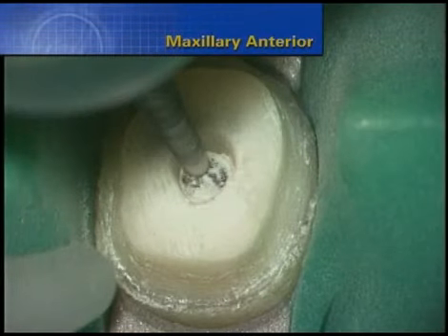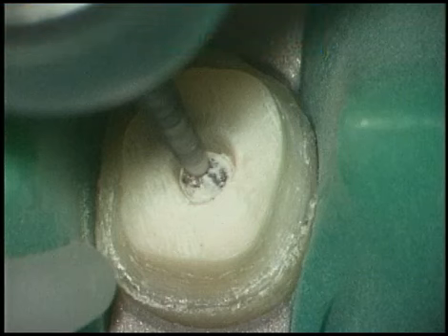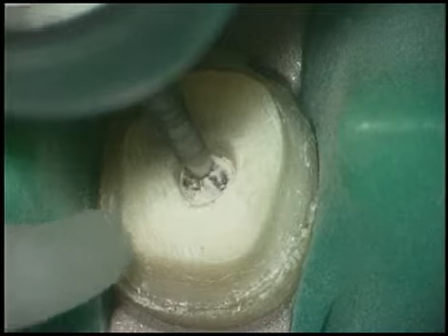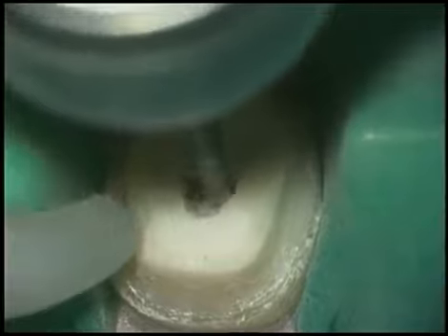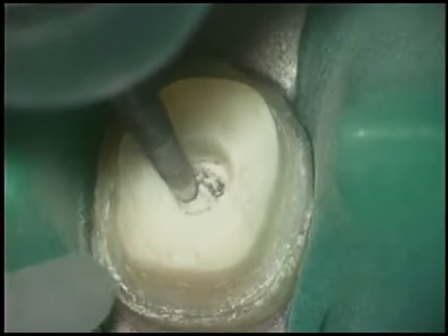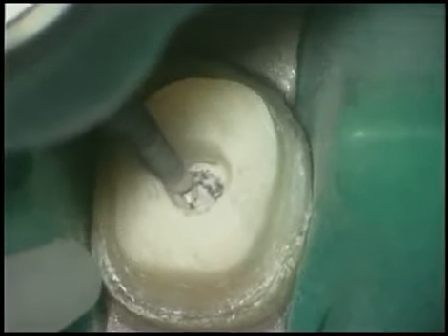It is increasingly common for dentists to encounter broken posts confined within the roots of teeth. Weighing risk versus benefit, we need to remove enough tooth structure to fully expose the post, but yet with an eye towards future restorative procedures. We need to preserve maximum remaining dentin when at all possible. Surgical length diamonds brush cut circumferentially around the post, flaring the access cavity.